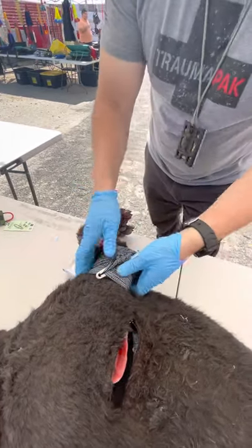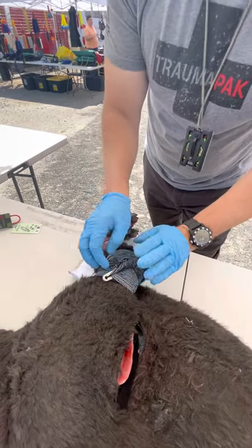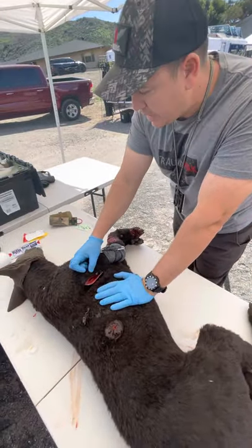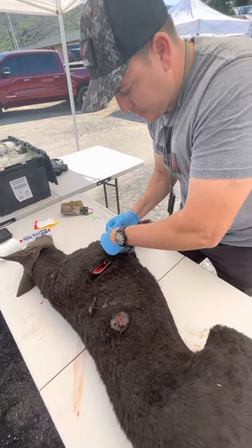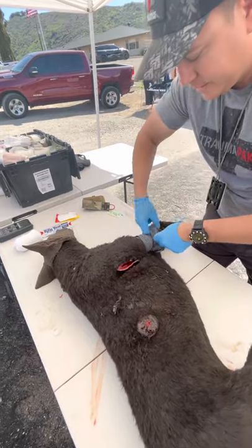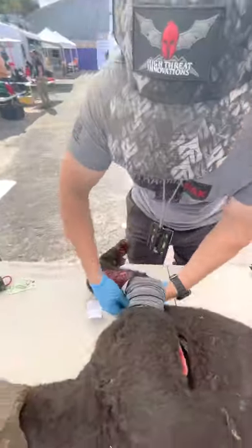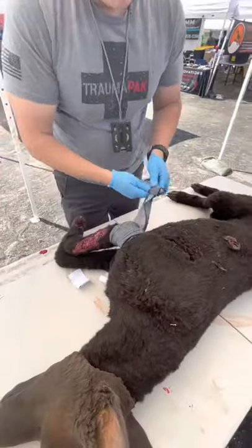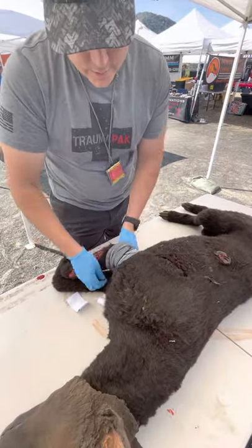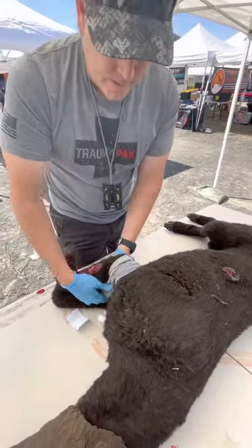That's a simple way of using minimal equipment. This could be an ACE bandage or a SWAT-T — we're using the elastic that we carry. We'll kind of back up now to packing this wound. You can see that it has multiple uses, and what I like the most about this is the length. Really like the ability to use that bar as a windlass over an ACE wrap.